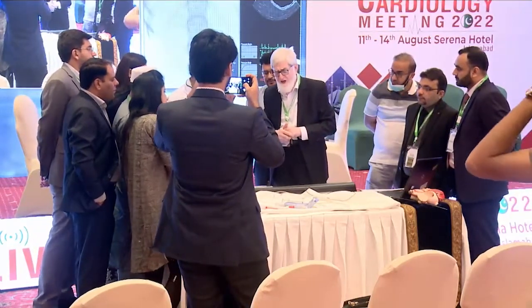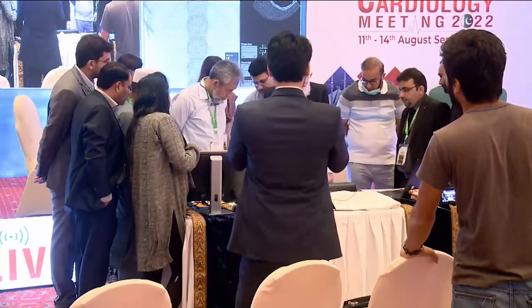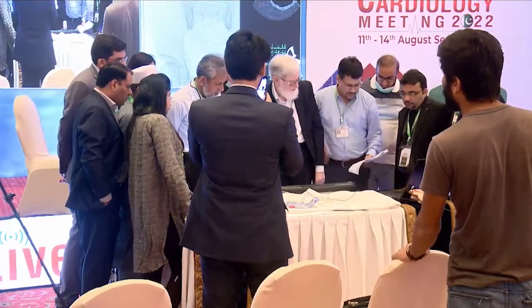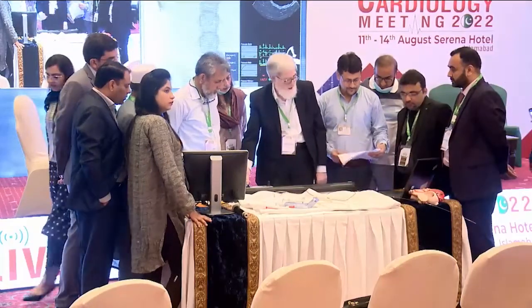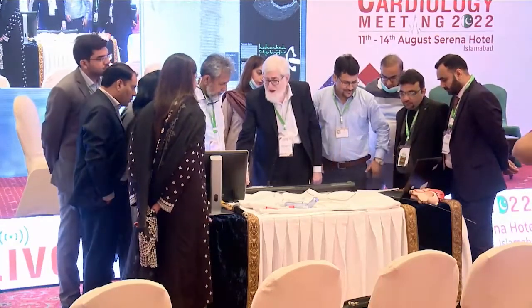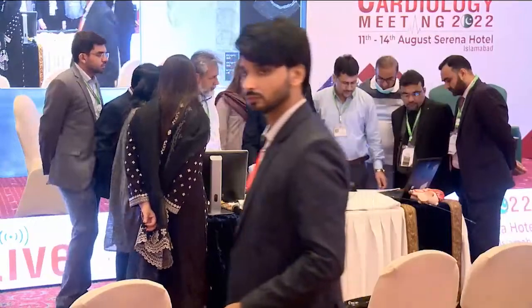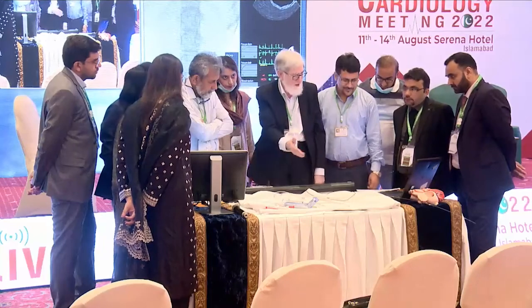That's another. So the first thing we do here, you all concentrate here. This is the fluoro, this is the cine, like in real life. You do the fluoro. You come here, caudal, and this is the cranial. And like you also change angles. So these things can be done quite nicely, and you change the field with these probes. You can change the tube, and here you can change the table position.